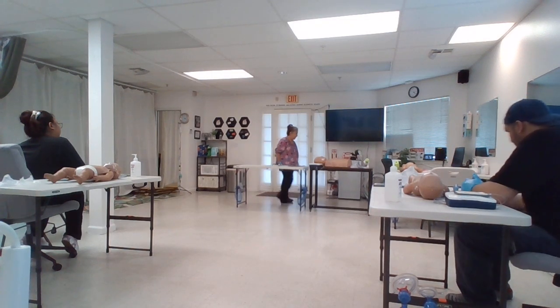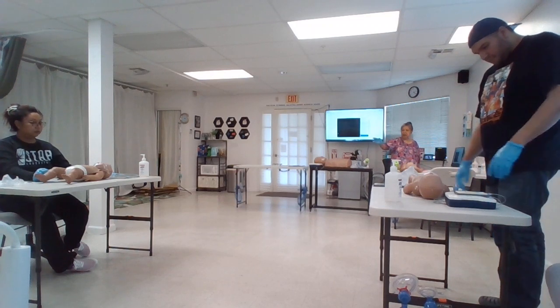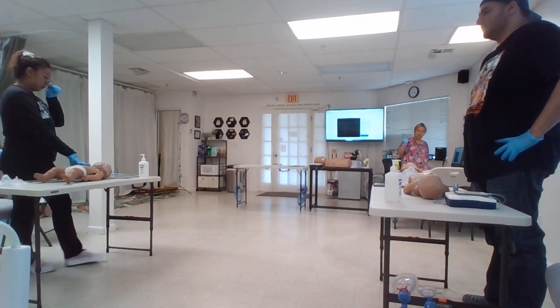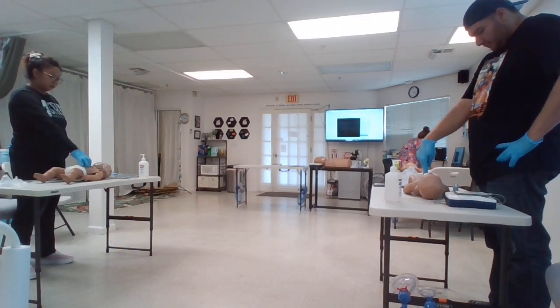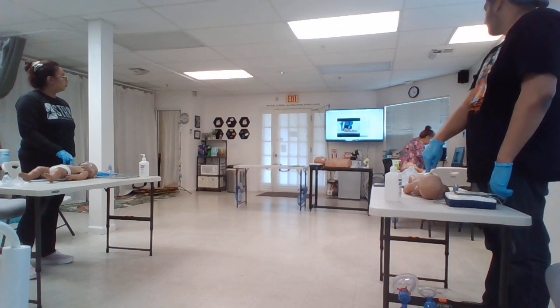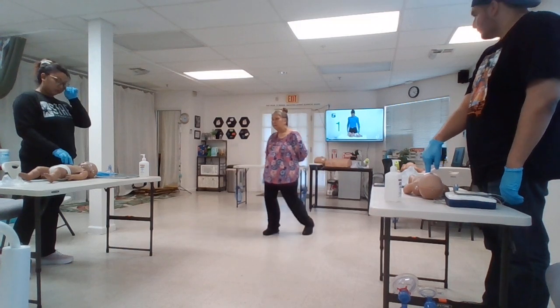Okay, so go ahead and practice compressions. There's a button on the baby's diaper. Go ahead and turn it on. Okay, now we'll practice while watching the compression feedback. Now place your two or three fingers right in the center and start. Get ready. Let's go in 3, 2, 1.